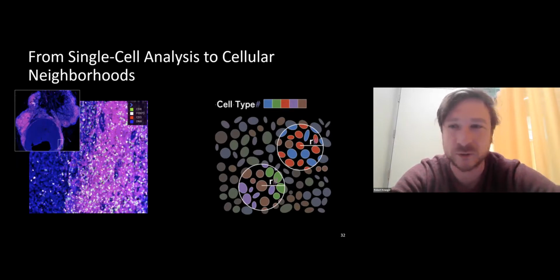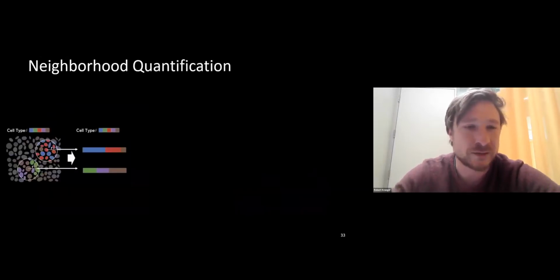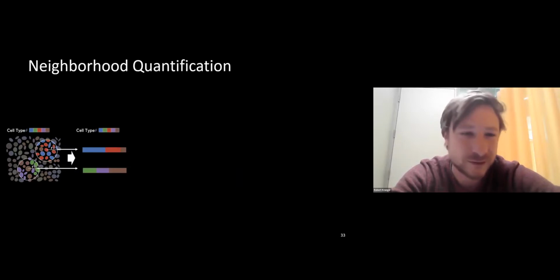distance-based. In order to compute the neighborhood, we do range queries for every cell. We look at what other cells are nearby, and this is already typed data, so every cell has a certain type, not looking at the original marker values. So for every cell, we look at what's in the surrounding neighborhood. Based on that, we can compute feature vectors. So we count the number of blue cells, red cells, and brown cells here in this case.